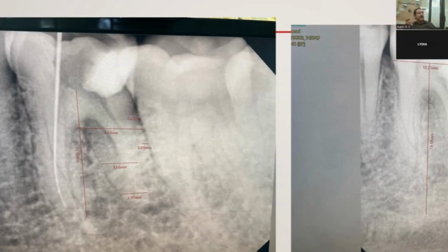Within 6 millimeters, how much will be your dead space? How much space do you have to spare between these two teeth? 1.5 on both sides, so that makes it 3. Your implant size is how much? Whatever you have, it's 3.3. So that area is barely a permitted one. 3 millimeters makes 3.3.